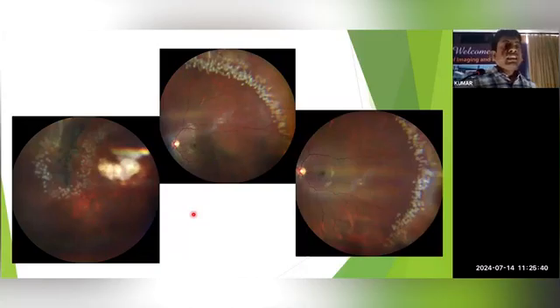Even for the residents and the fellows, if you have the image in front, you can tell them this is the area you have to laser, how many rows you have to give. If there is a large 360-degree lattice with some holes, which area you have to go and join to the ora serrata. So all this helps in better teaching and better management of the patients.